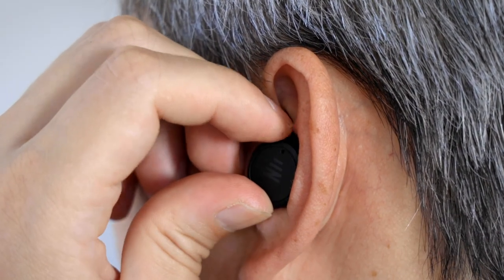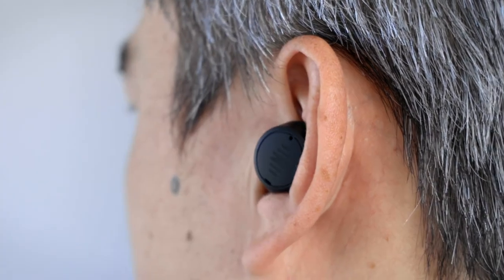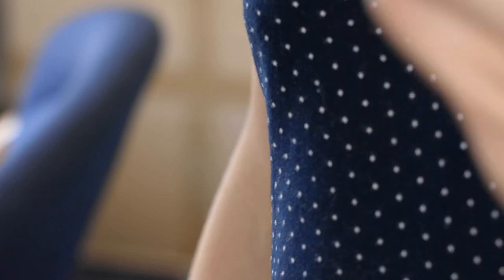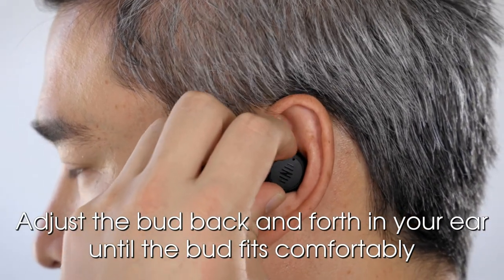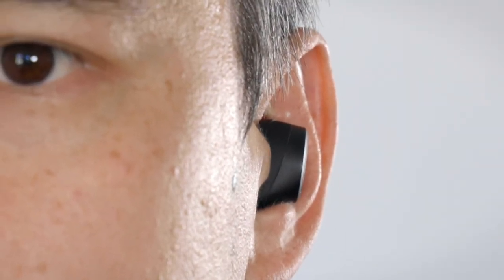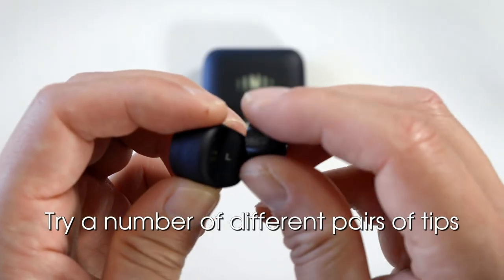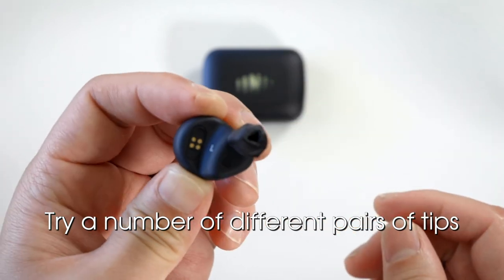If you do not hold the bud in place while the foam expands, it may push the bud out of your ear. If this happens, repeat the procedure by squeezing the tip again before insertion. While applying gentle pressure, adjust the bud back and forth in your ear until the bud fits comfortably. This will ensure the best seal. If you try to insert the bud this way, a seal will not be formed. Try a number of different pairs of tips to assess which provide the most comfortable, firm seal in each of your ears.